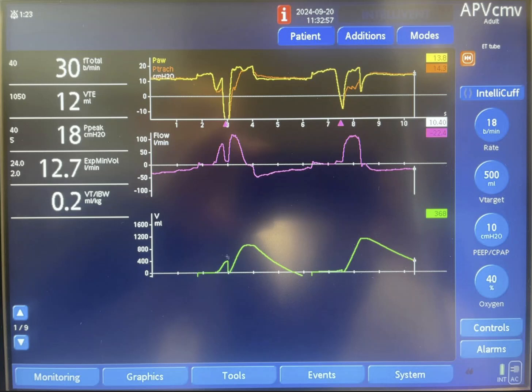That 900 is added to the previous 400. The decrease in displayed total volume to zero here is just a recalibration in the system because the next breath started. So what we have inside now is 400 plus 900 — almost 1300. Then there is a prolonged expiration to this point here.